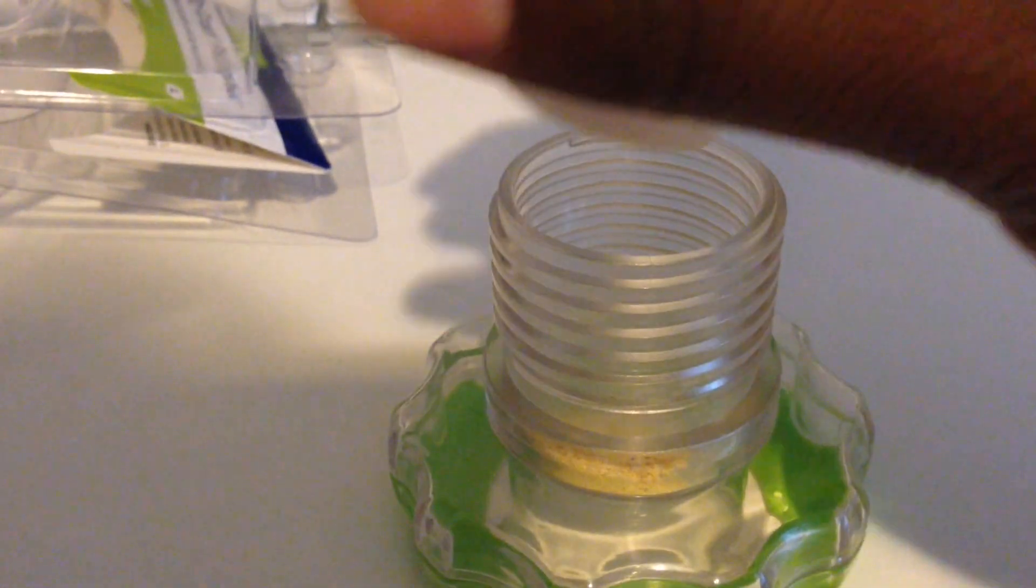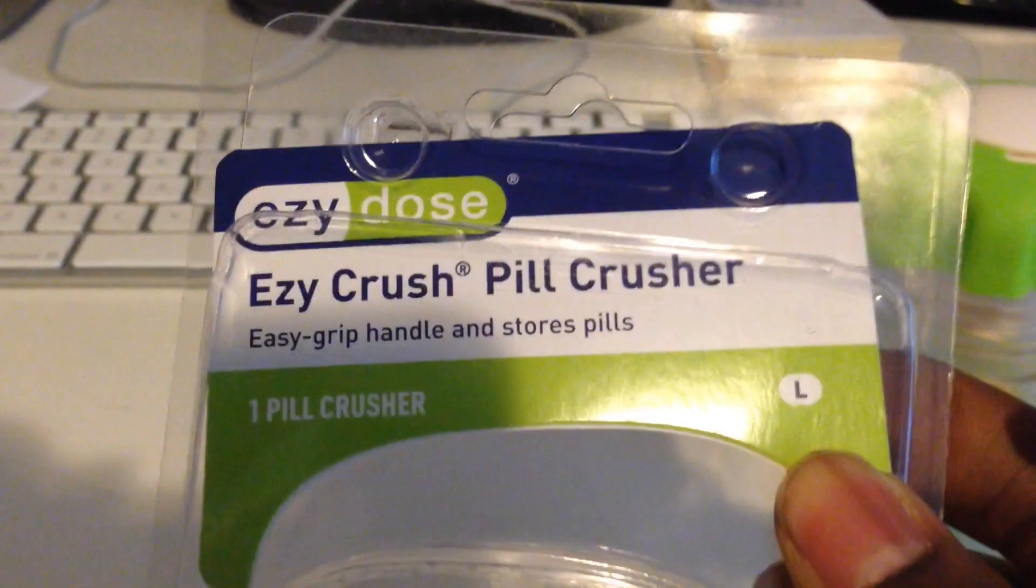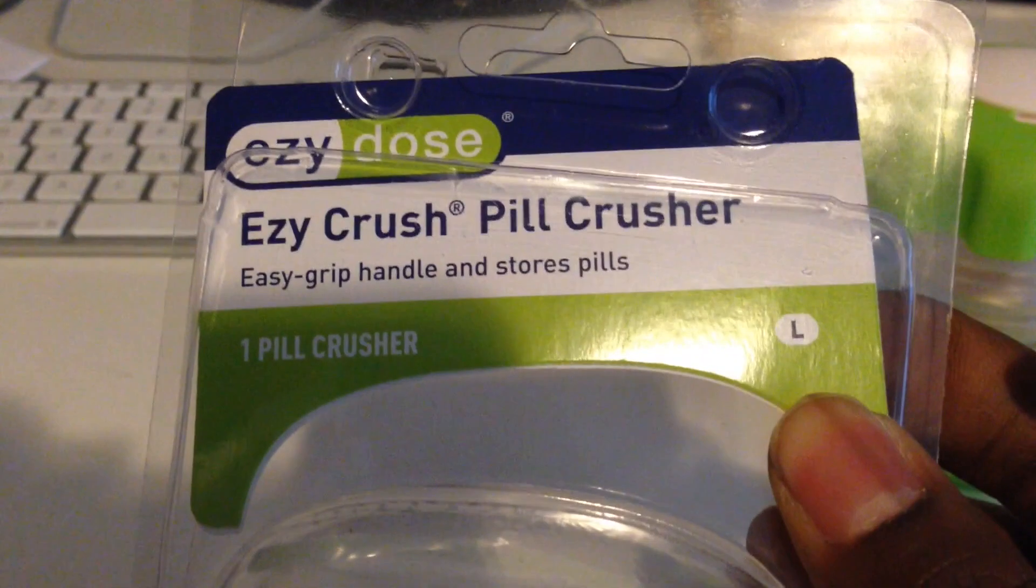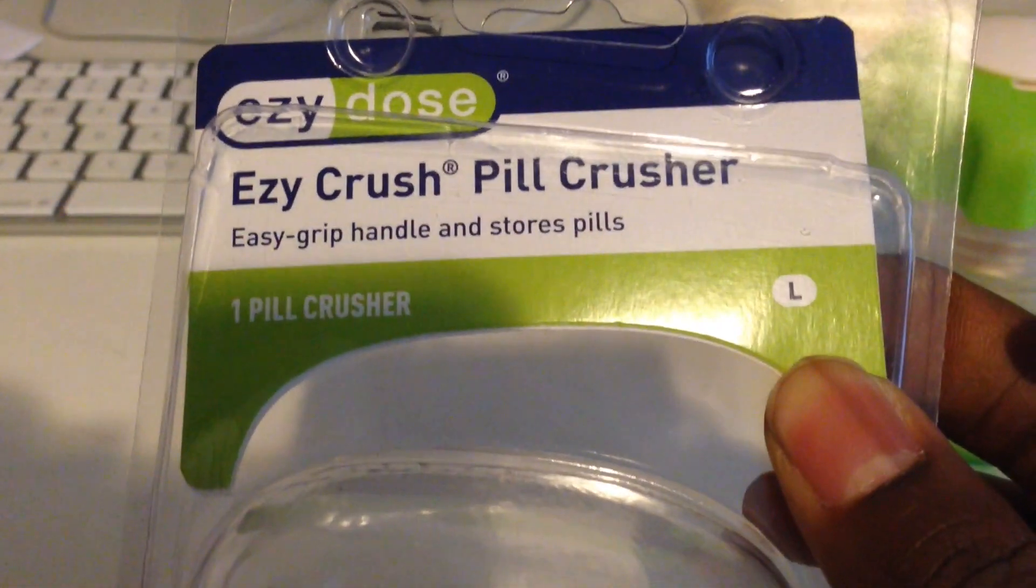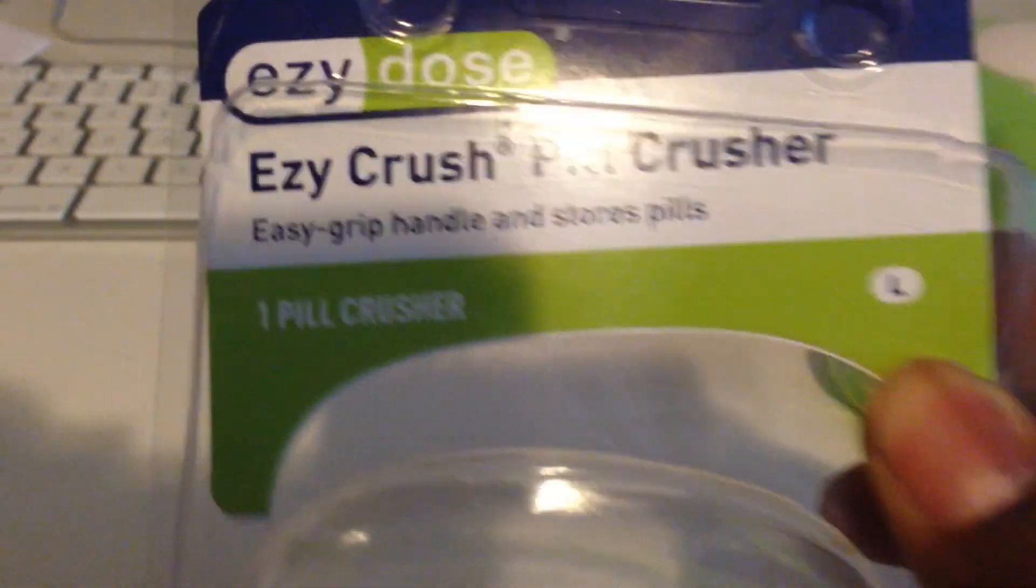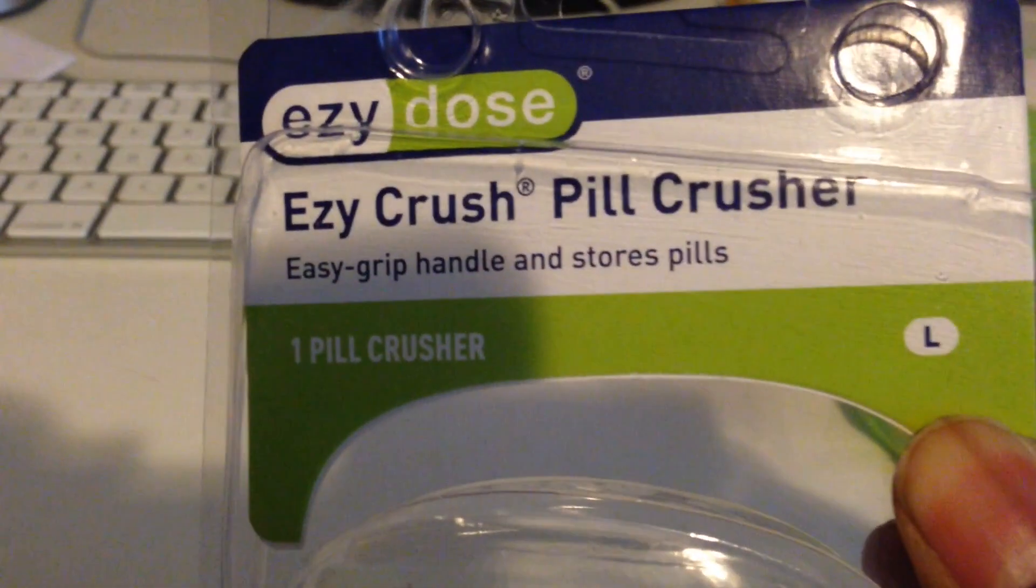So far it works as advertised. Again, this is the Easy Crush Pill Crusher, Easy Dose Easy Crush Pill Crusher. Like I said, I got it on Amazon, I imagine you can get it anywhere else. But that was it.